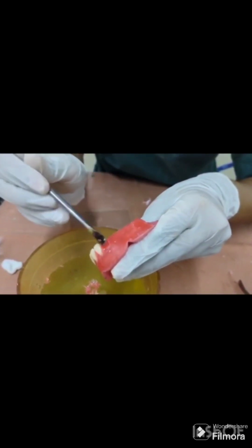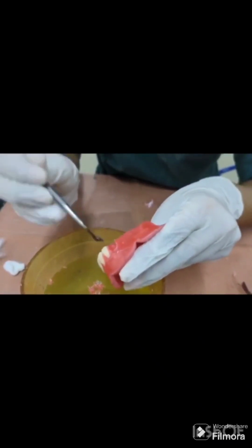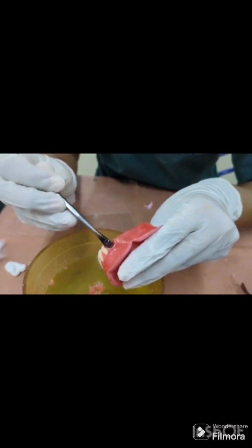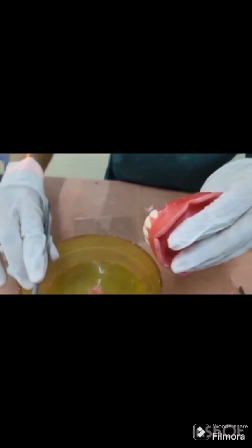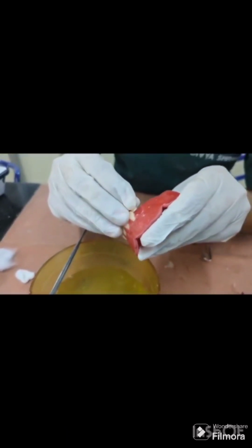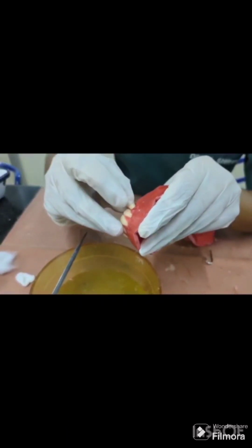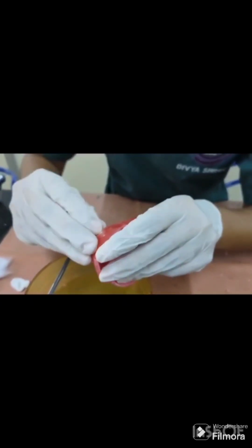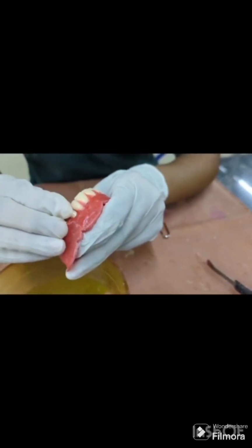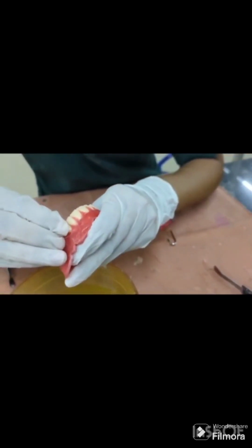Next, arrangement of the maxillary canine on both sides. Its long axis is parallel to the vertical axis when viewed from both the front and side. The cervical margin of the canine is more prominent when compared to the central and lateral incisor. It is less for a patient with a square face and more if the face is tapering.